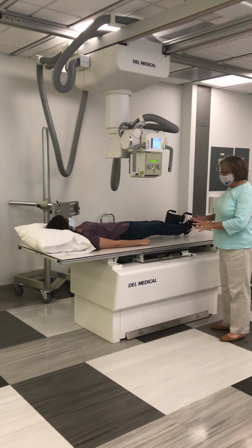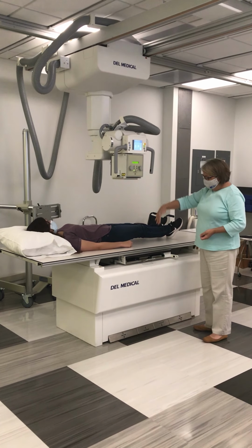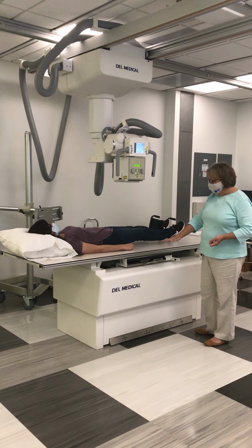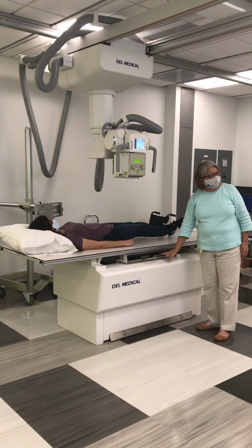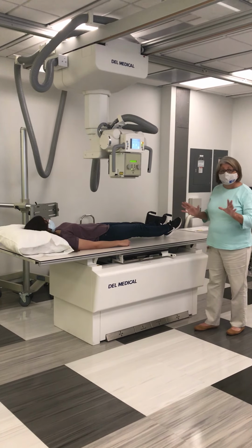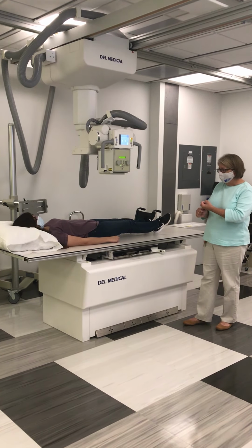Now I have my equipment set. My tube is in transverse detent. My central ray is aligned to my image receptor. My image receptor is in the Bucky tray properly. The Bucky tray is closed completely, and I have my marker on. From this point forward, all that I do is position my patient on the table correctly, and then center correctly.